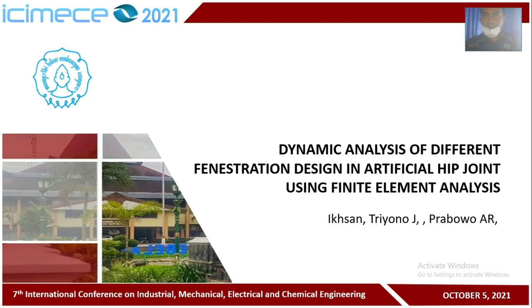The aim of my project is an attempt to analyze the hip shaft which is used as an implant, with the treatment of gaping holes in the implant shaft. Analyses were performed on implants with three types of fenestration compared to implants without fenestration. The analysis also compared SS316L and TI6AL4V materials. These two materials were chosen because they are metals that are widely used as implant materials.